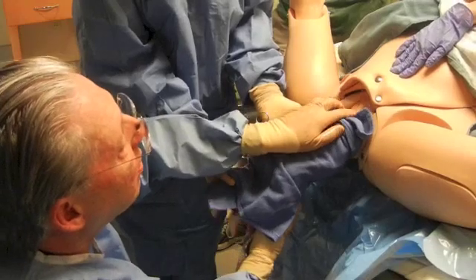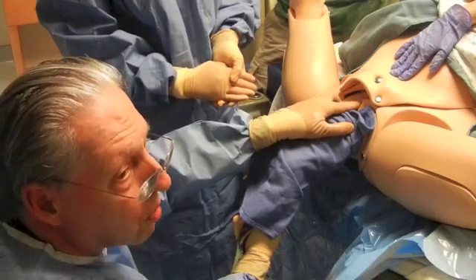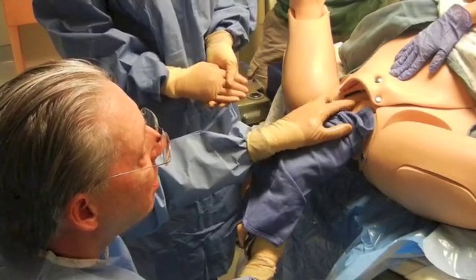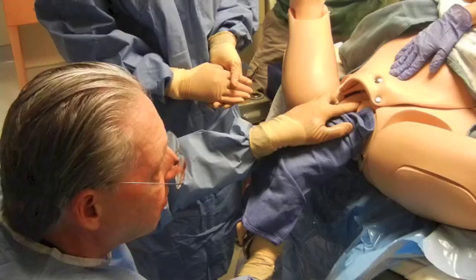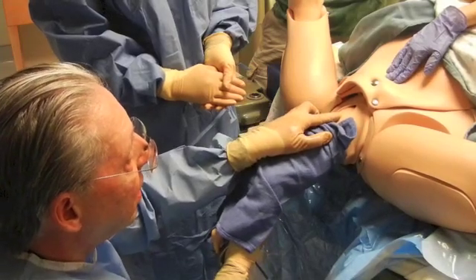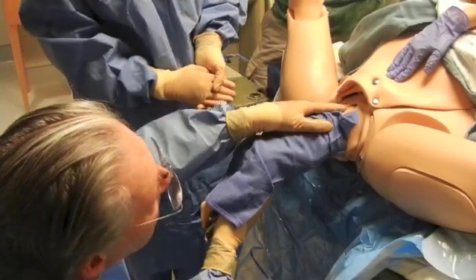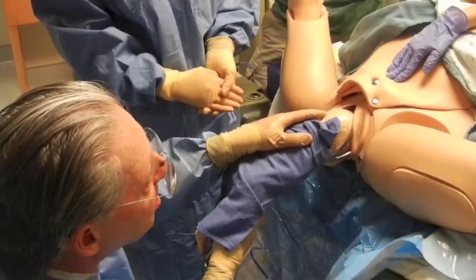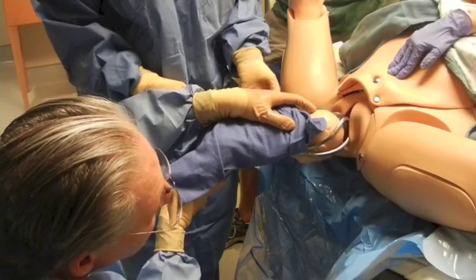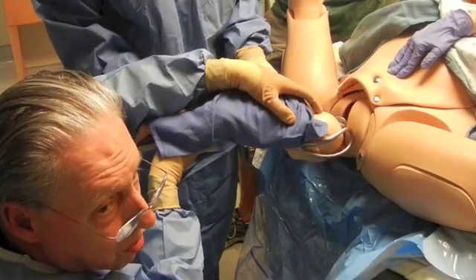Pull with a steady downward traction — not jerking back and forth, twisting, or doing anything to extend the head. Keep one finger on the back of the occiput to keep the head flexed. Back down and pull steady. You can evaluate the perineum to see if an episiotomy is needed, and if not, just keep pulling steadily. Do not bring the blades above the horizontal, because the toes of the blade would otherwise be highly likely to cause a sulcus tear.